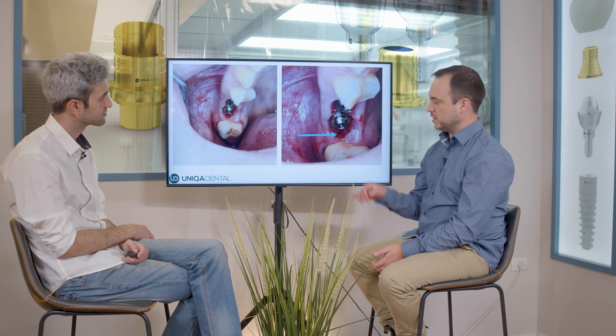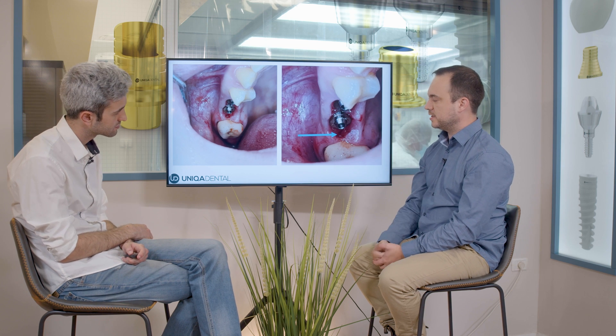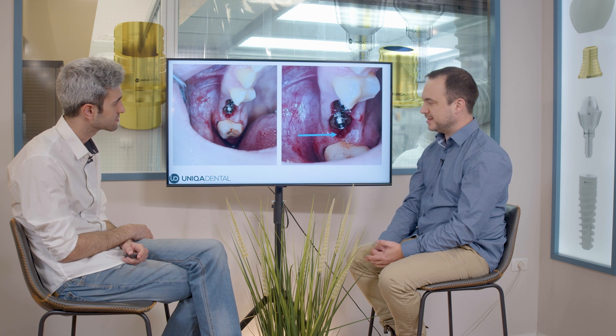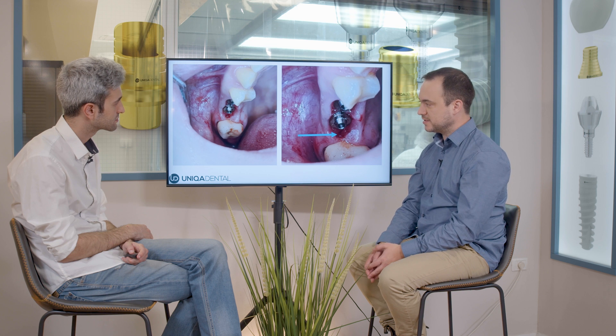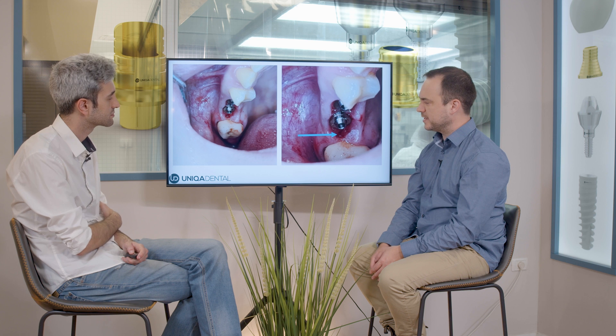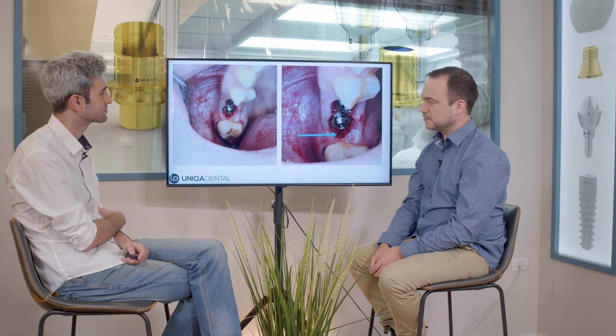Here you can see where the food got stuck between the multi-unit and the crown. These are very old multi-units and implants — I think they were made about 15 years ago — and this is what happened.